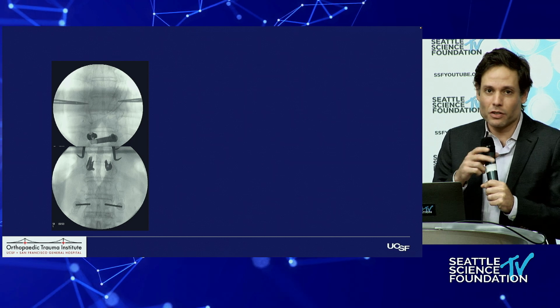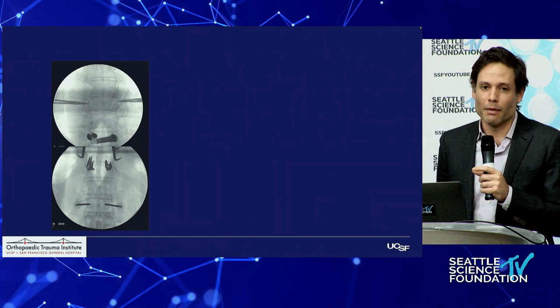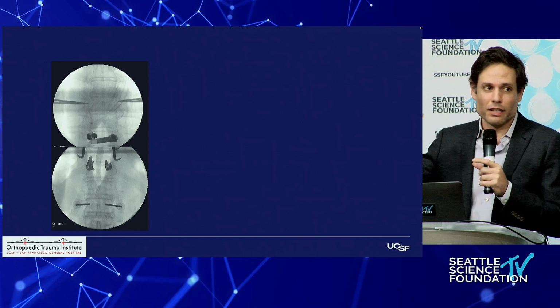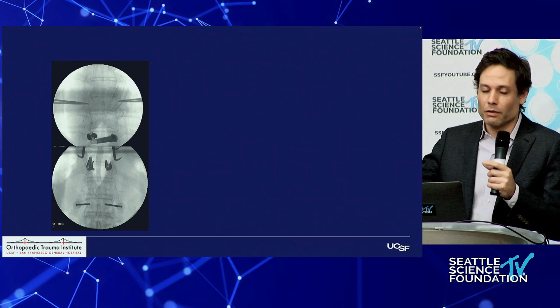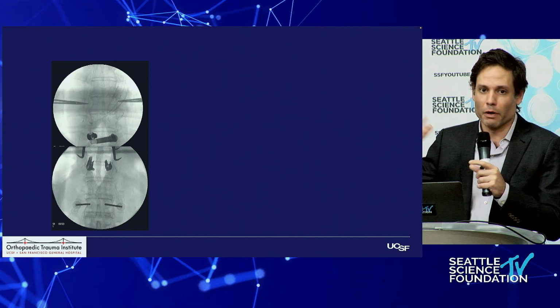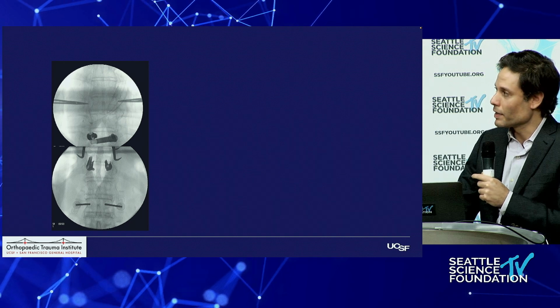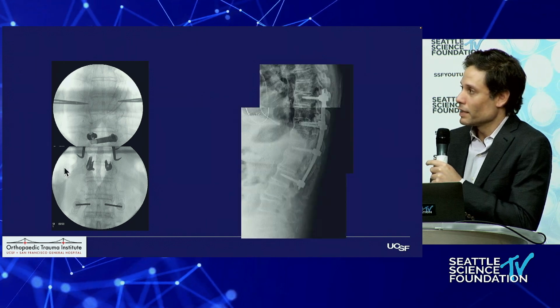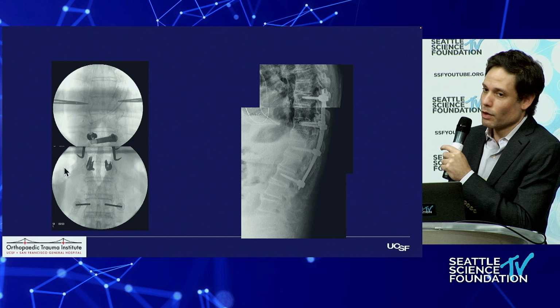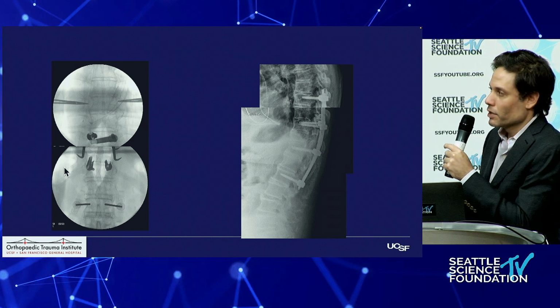With these ankylosing spondylitis fractures, it's really just 2 pieces of bone. We don't need to have screws at every level. If this was a long bone, we would. It's just near, far. Going back to our external fixation principles, all our posterior instrumentation is essentially like an internal external fixator. We did a mini open to minimize the dissection. So even though we do a decompression, we just limit the open portion to that decompression.